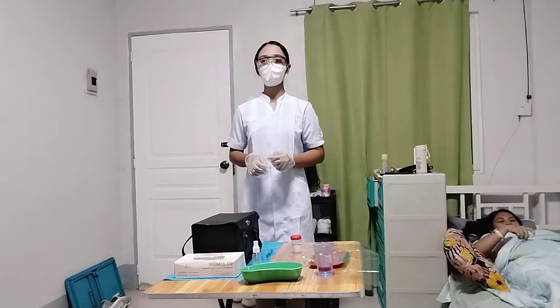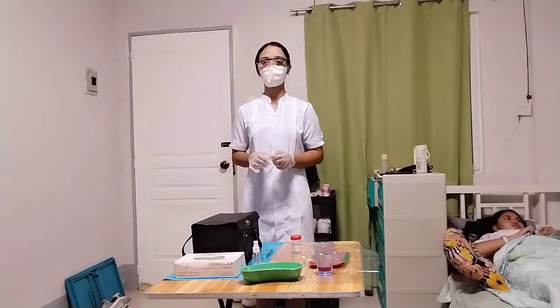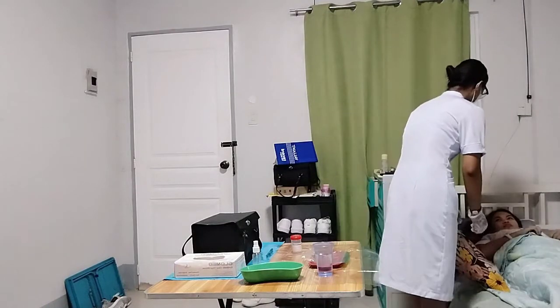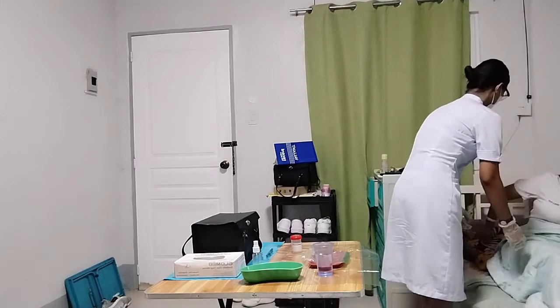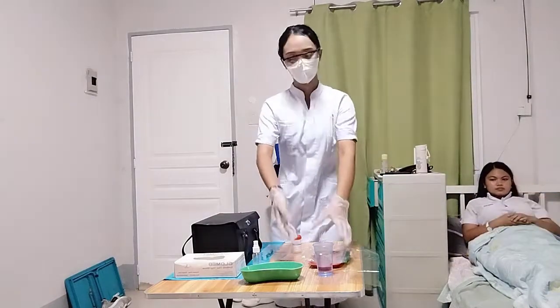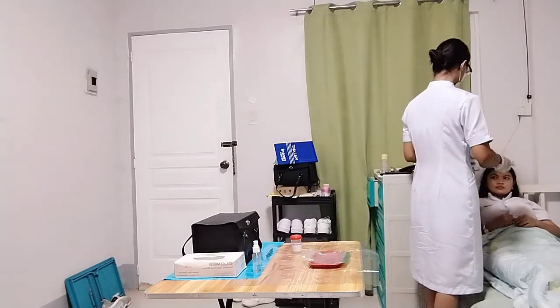Place the client in semi-Fowler's position, have the client clear the nose and throat and rinse the mouth with water before beginning the procedure. So usually the specimen collection is done early in the morning before having breakfast. So ma'am, let me assist you in semi-Fowler position po. Thank you po. Ma'am, using this water, rinse your mouth.